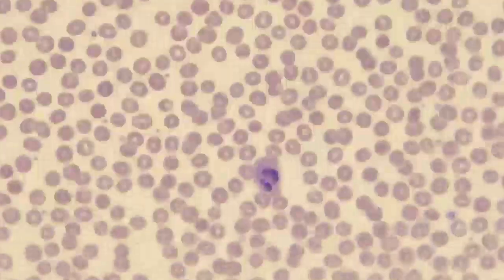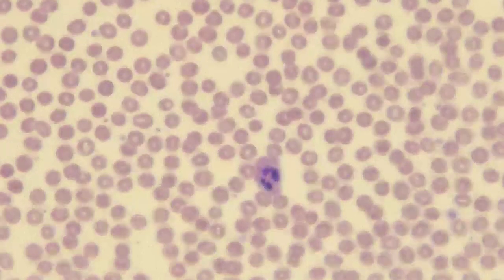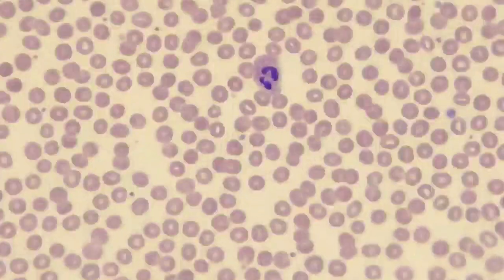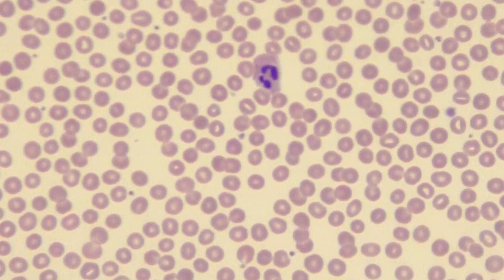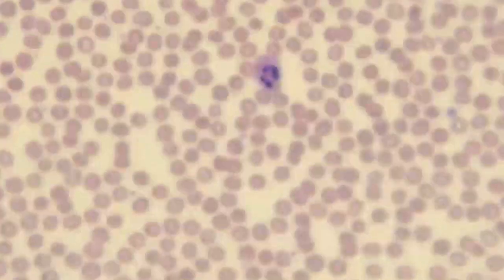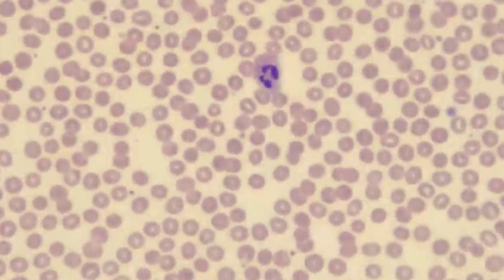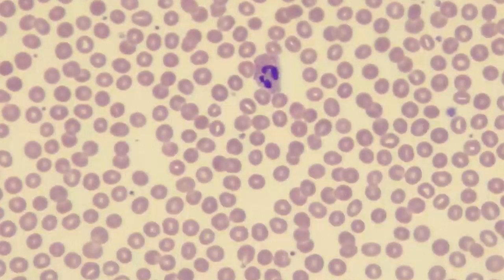Okay, so for me, this looks pretty good. We've got a segmented mature neutrophil there in the center. The red cells are just sometimes kind of touching each other. Another thing that we're going to want to do is assess the quality of the stain. So what that means is that the red cells should have kind of this pinkish tan color.